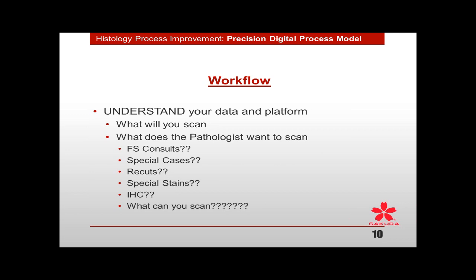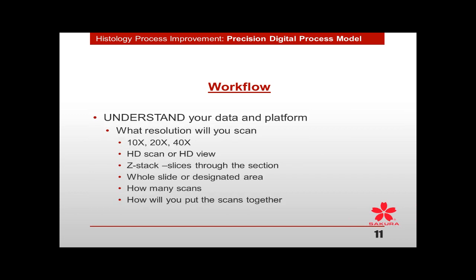Then you can decide what kind of digital scanner and how much IT you need, because sending one image over a system is not going to change things. With more than one pathologist and more than one image, you can quickly shut down your intranet and your LIS if you're not in that discussion with IT about what you're going to be putting onto this system.